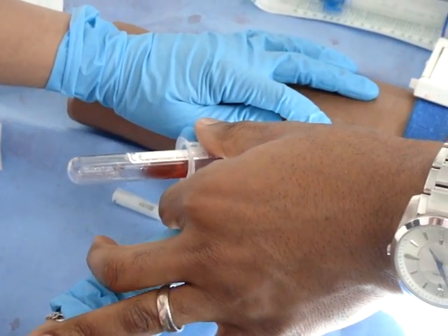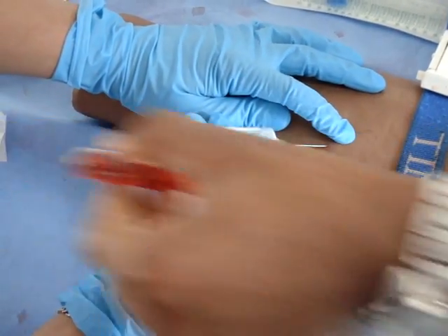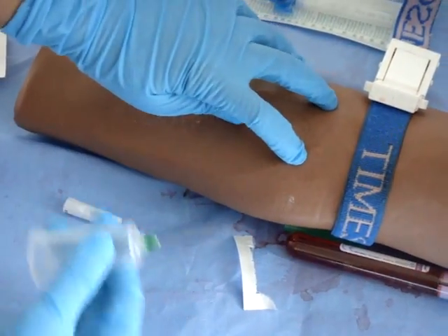Remove the tube and then the needle. Place cotton wool onto the injury and press down. Remove sharps and dispose of safely.